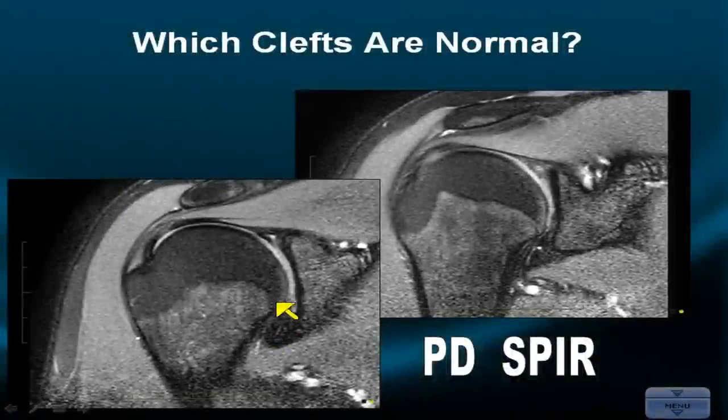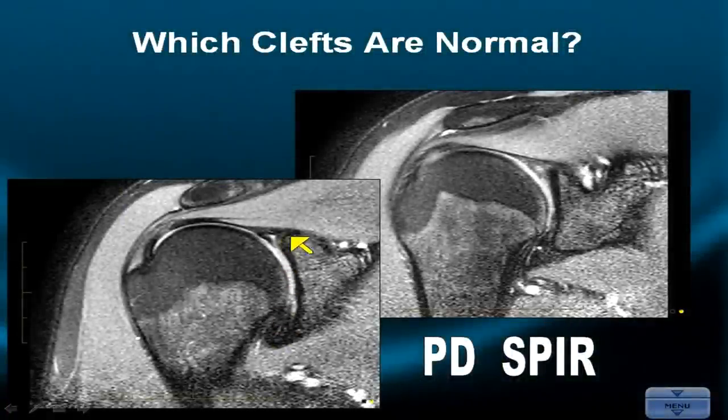The posterior quadrant is a secure, consistent place anatomically. Here we have a signal in the mid-coronal plane that persists into the posterior quadrant — it's abnormal. It's a type of superior labral tear, anterior to posterior, or SLAP lesion, whose categorization is a story for another day.